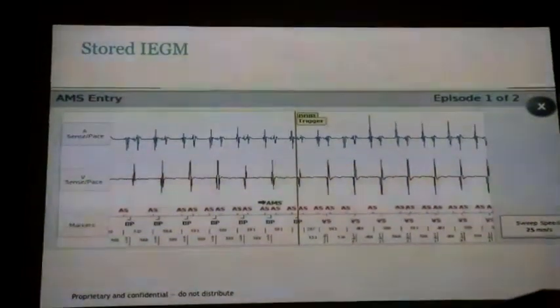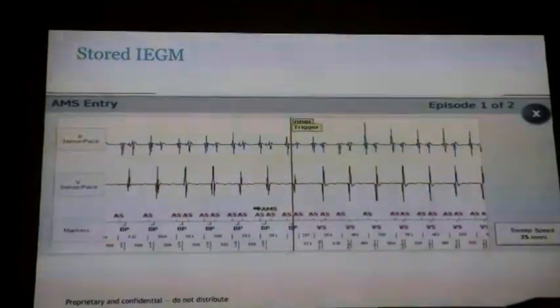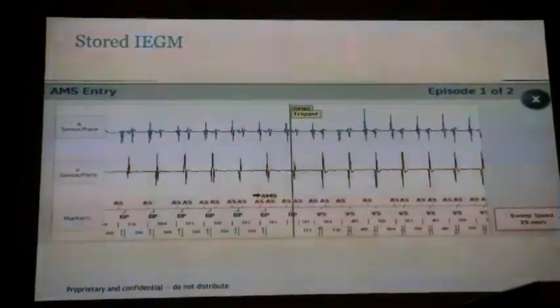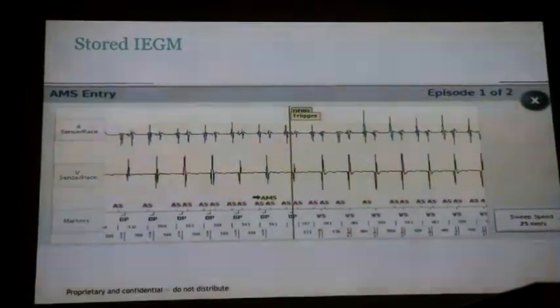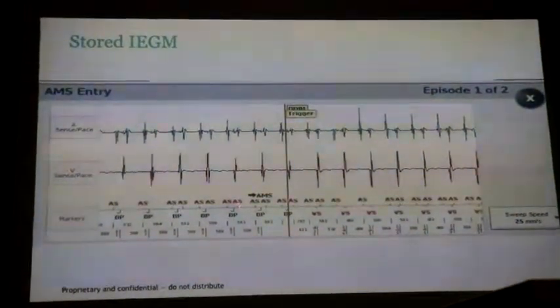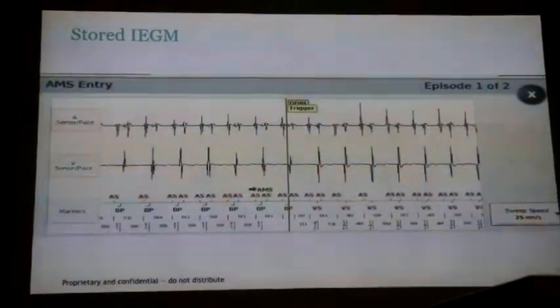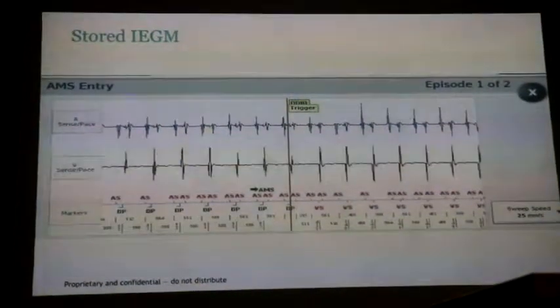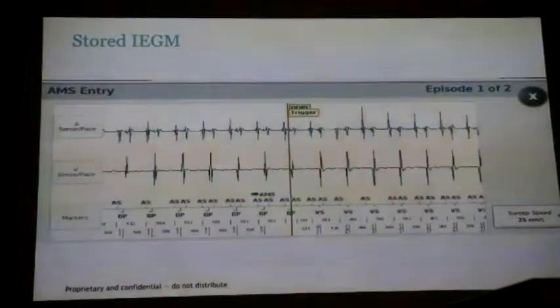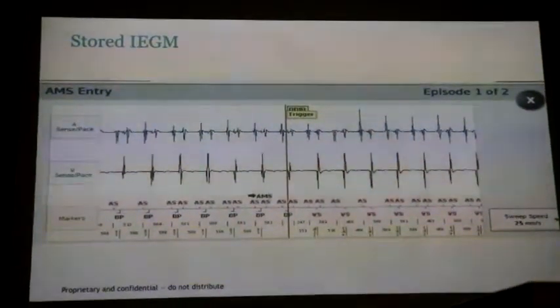Yes, other devices they give you a blank AB, so they'll tell you that it's in the blanking period. We'd say if it's in blanking, it's fine. Yesterday you showed a similar pacemaker, I think, and it said AR. AR, yeah, that's A in the ventricular refractory period. But they're very close to the pacing, so how come it is not in the blanking? It's just outside blanking. Blanking on this device, I think, is 80 milliseconds. It's really short. It is outside blanking, in PVAR. So how come it says sensed, not AR?